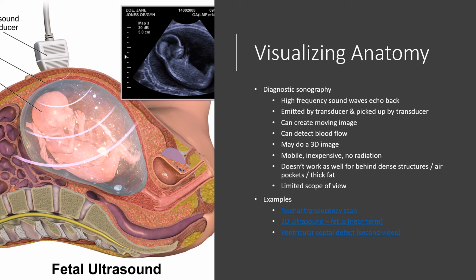If you were looking at something that's behind bone, you're not going to see it at all, because the sound waves are all going to bounce off the bone and they're not going to make their way through. Please look at these examples. Again, those links should be working with the PDF.